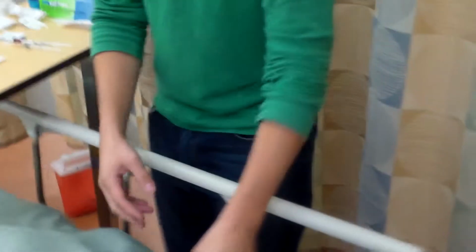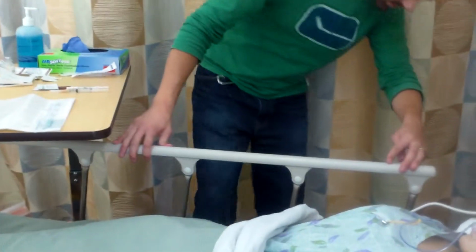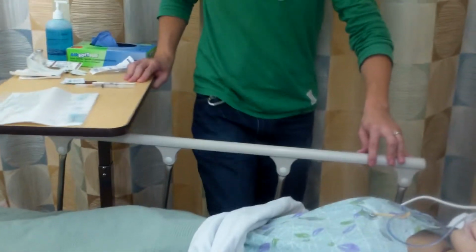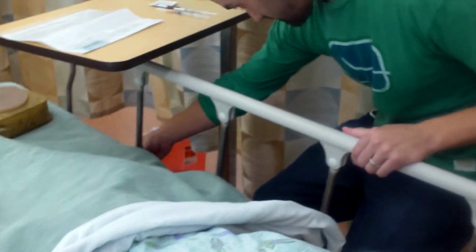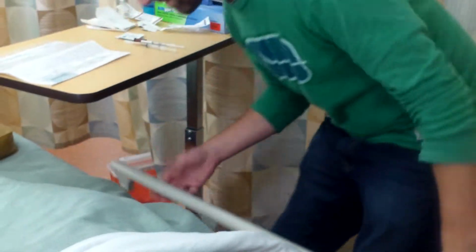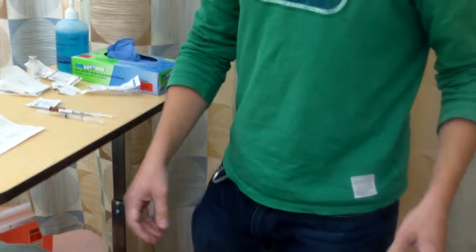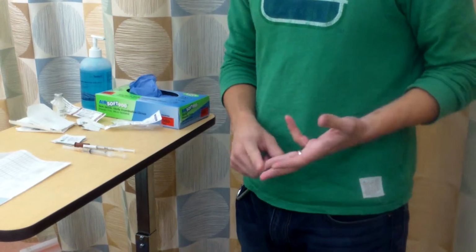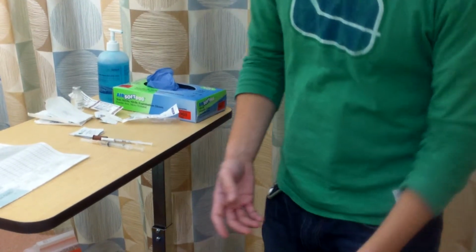So I need to administer a subcutaneous injection as well as the intradermal. So I want to make sure I'm at a good working height for myself. There we go. So I have medication there. And I want to tell him all about the effects of the drug, what to expect, and the reason why he needs this drug, and make sure that he's compliant. And if he is, I will go ahead and administer the drug.